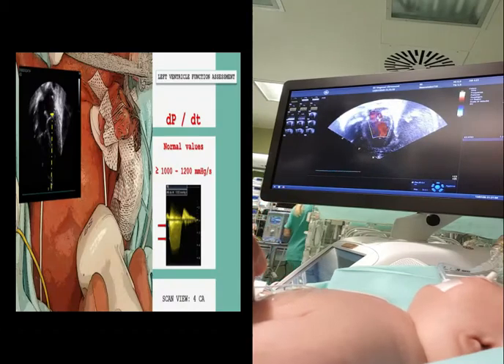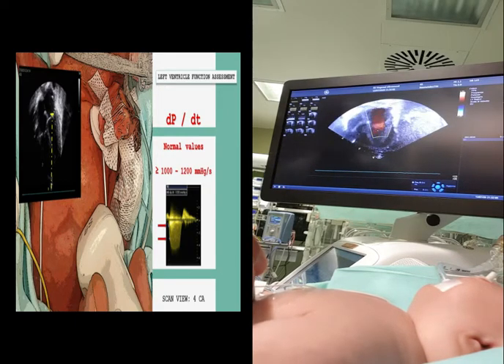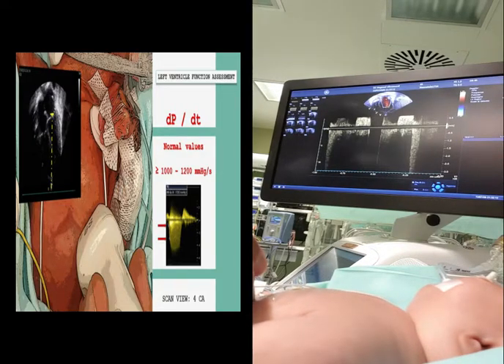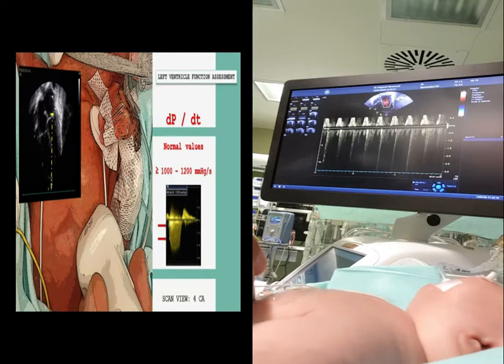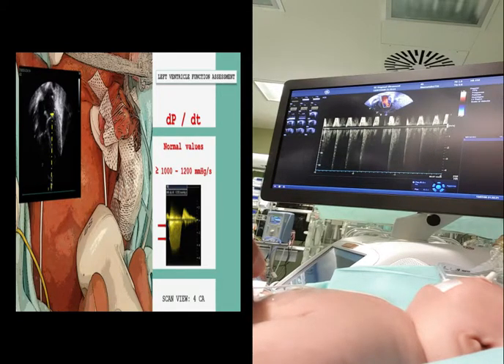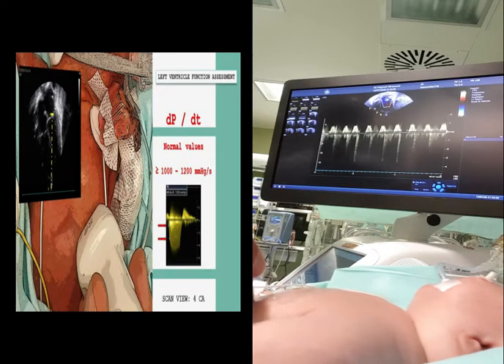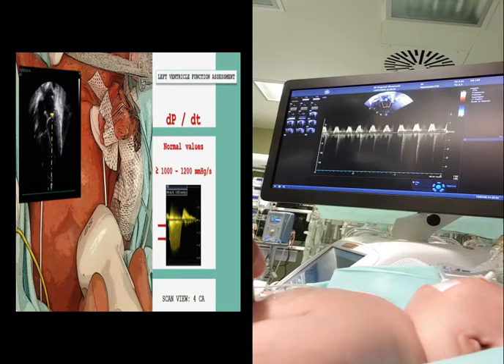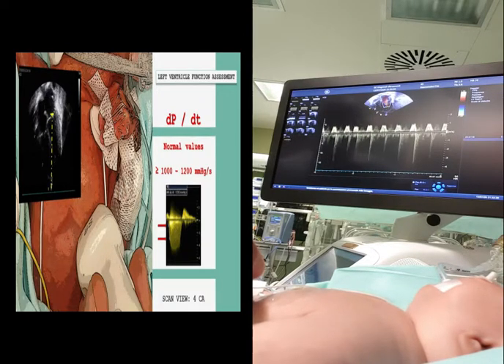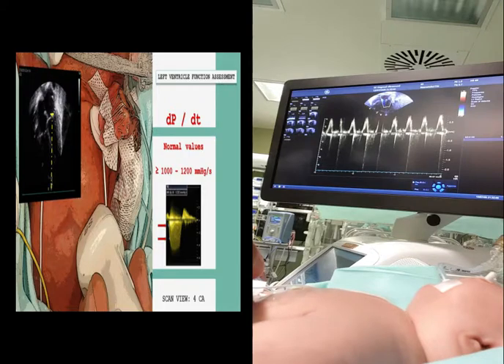In the presence of mitral regurgitation, the rate of pressure rise in early systole may be used to evaluate global left ventricular contractility. As there is no significant change in left atrial pressure during isovolumetric contraction, the index reflects left ventricular pressure changes. Using continuous wave Doppler, the mitral regurgitation spectral is acquired to calculate the dP/dt ratio, which represents the time duration between a change of velocity from 1 to 3 meters per second on the mitral regurgitation spectral. The normal value of mitral regurgitation dP/dt ratio is greater than or equal to 1000 mmHg per second, and a value of 500 mmHg per second is indicative of severe systolic dysfunction.